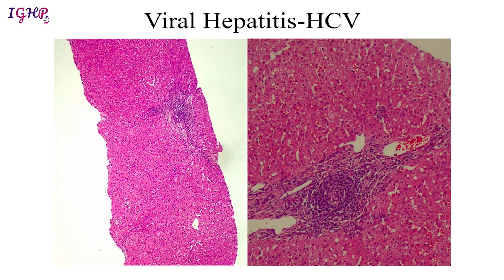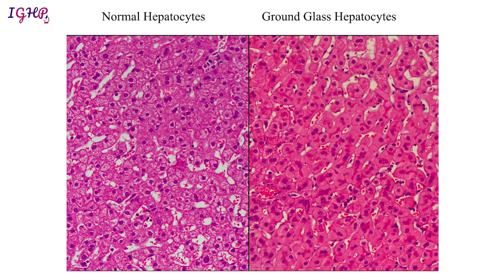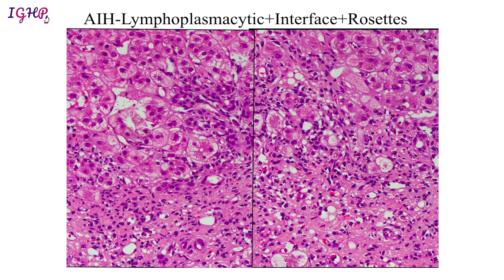In some viral hepatitides like hepatitis C virus, we see the presence of lymphoid aggregates within the portal tract, as seen here. In hepatitis B virus there is presence of ground glass hepatocytes, which are different from normal hepatocytes. Compared to normal hepatocytes which have a rarefied cytoplasm, ground glass hepatocytes have an eosinophilic glassy cytoplasm due to accumulation of hepatitis B surface antigen, which can also be confirmed on orcein stain or Victoria blue stain.